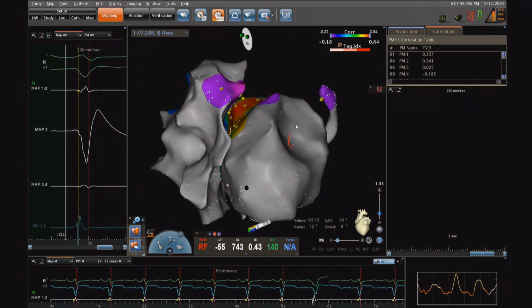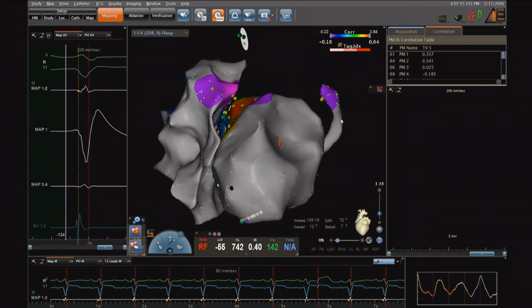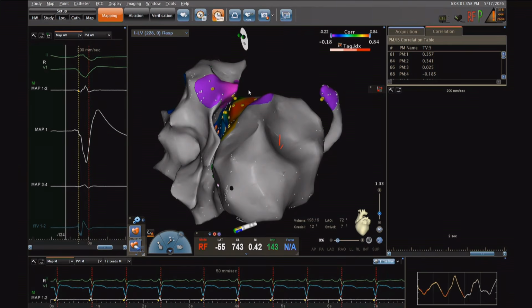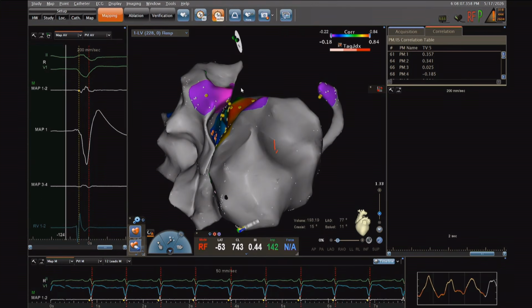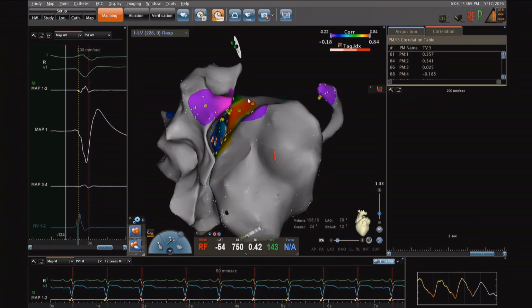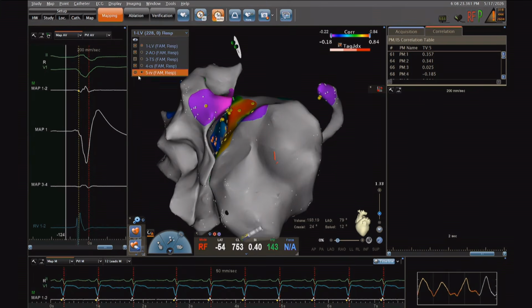So Joseph changed to a smaller catheter. You cannot see it on the screen, but pushing the catheter deeper in the CS, it could arrive approximately to where you have this arrow moving right now. And here, again, the percentage of correlation in this area was around 60 to 70 only. So different options: either it's intramural or maybe this is closer to the cusp, so we can change the sheath and go to the right cusp, and then.